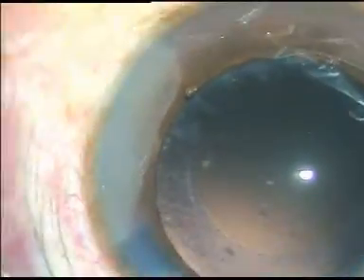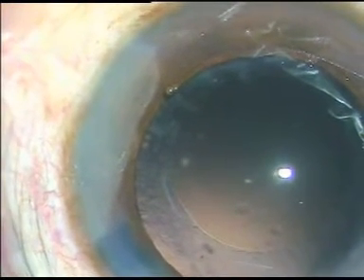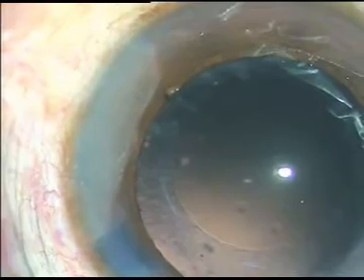Now viscoelastic substance is injected into the anterior chamber and the IOL is implanted in the capsular bag. This is the IOL. The IOL is placed over the cartridge and the lens is folded inside the cartridge like this. Care is taken not to entangle the haptics inside the lumen of the cartridge.